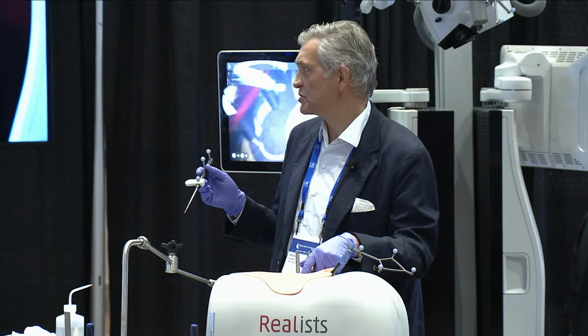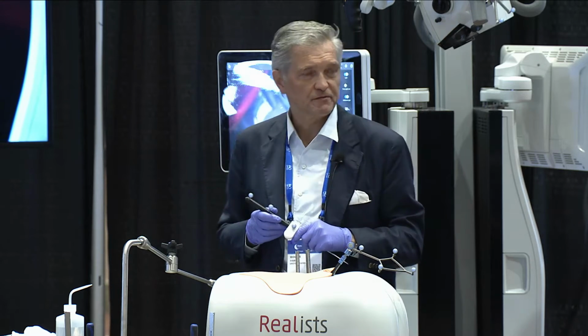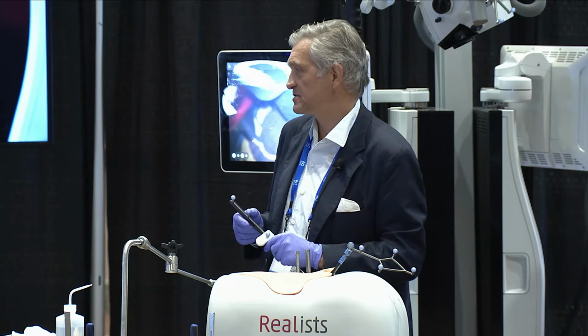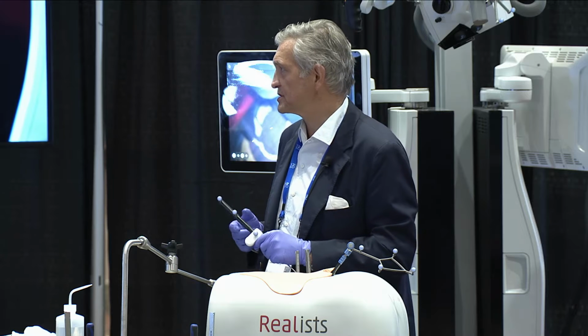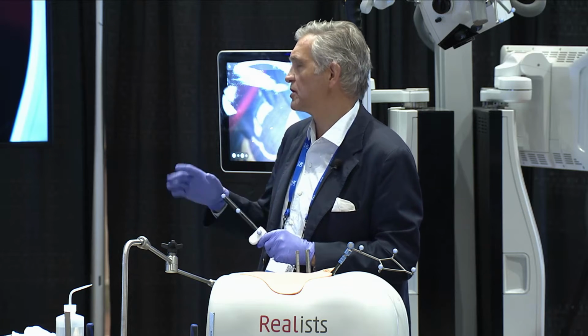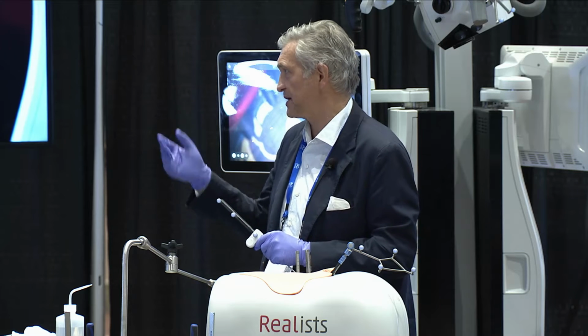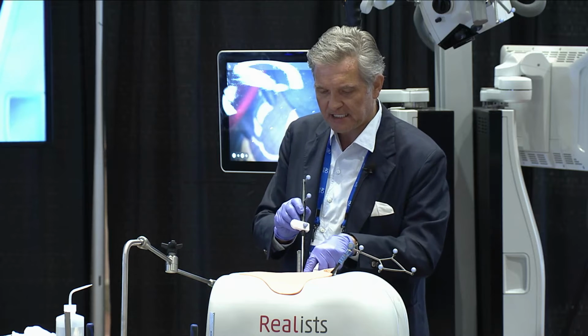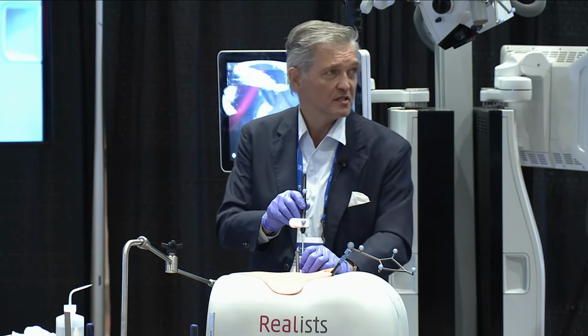Yeah, because you can make sure you avoid the superior facet, for example. It's very accurate. That has been published. The accuracy is increased compared to freehand navigation compared to fluoroscopy. Yeah, great. You can maximize, and like I said, you can also pre-plan the screws, which is something that I don't typically do.